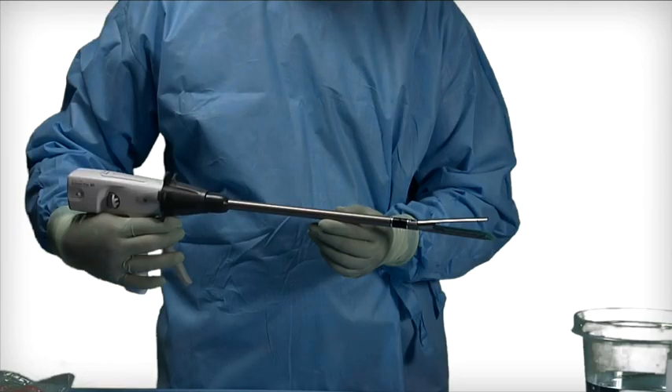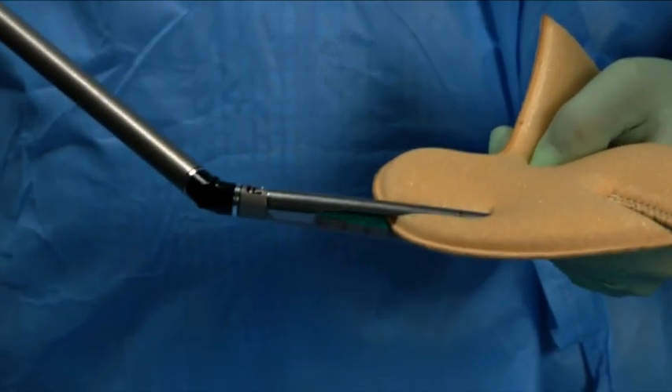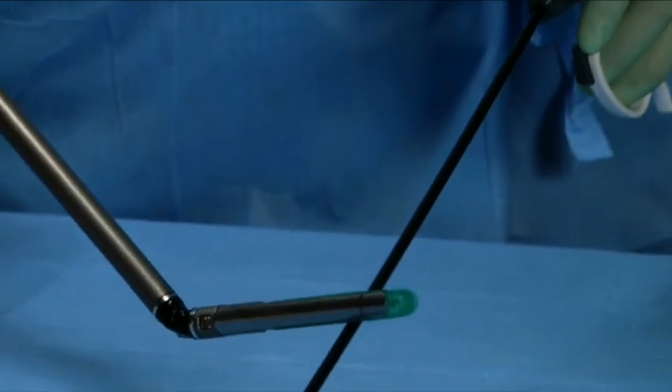Articulation can be achieved four ways: pressing the end effector against the body wall, tissue in the body, a grasper, or hand assisted.